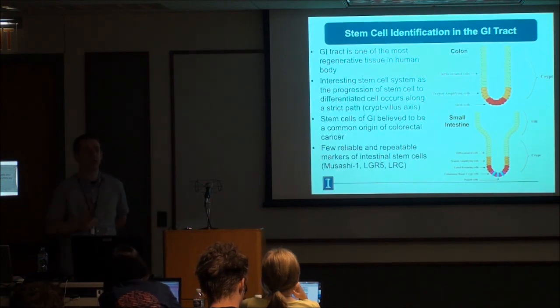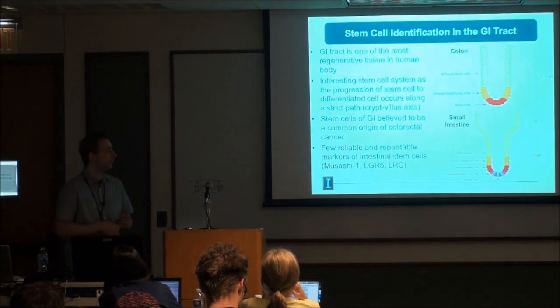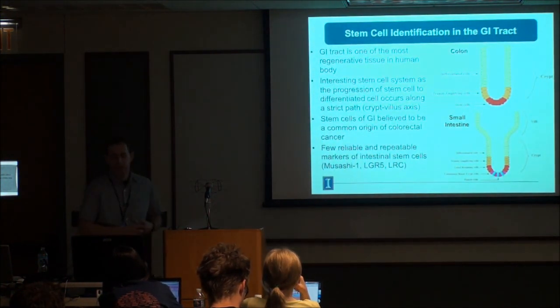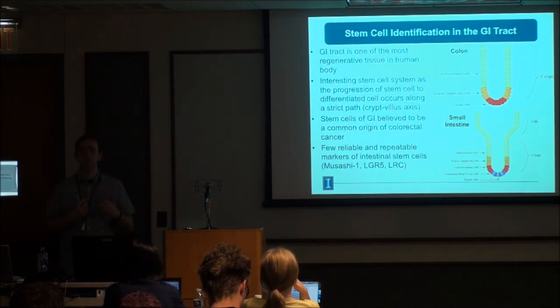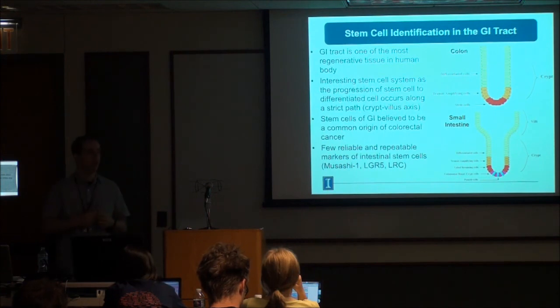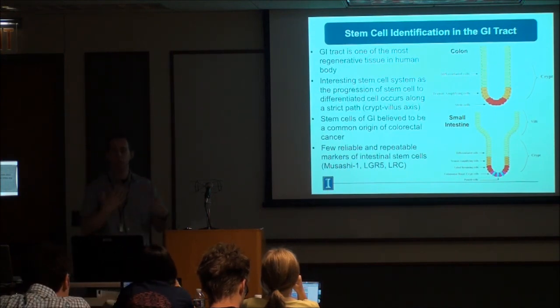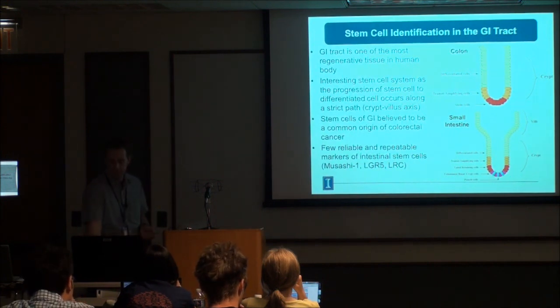Adult stem cells are very, very difficult to identify, certainly using conventional stains. So we want to see, do stem cells and transient-amplifying cells have a unique biochemistry which can basically segment them out from the surrounding differentiated cells?